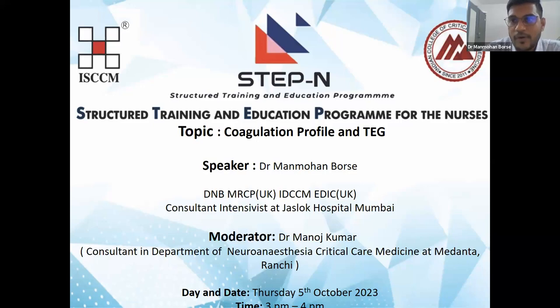As the power is decentralized, TEG is getting available in tier 2 and tier 3 cities as well, because it's a point of care test and we can assess the blood and blood product requirements for that particular patient, particularly in liver failure or DIC patients. So TEG is important. My lecture will have the first half on coagulation profile and the second half on TEG. I have covered almost 18-20 slides on TEG, so it will be new for a few of you. That's why I have given extra time for TEG.